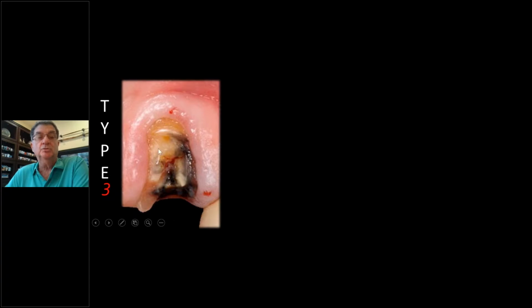Now you see, if I tried to do everything at once, even though he has a low smile line, I'd have to bring the mucosa down. I'd have to pull the flap down. I could do it, and many clinicians would do it. But then you've got to push the mucosa up, and you lose all this chance of getting beautiful tissue in here. So this guy's walking around like this.